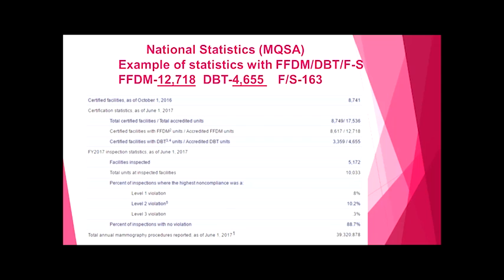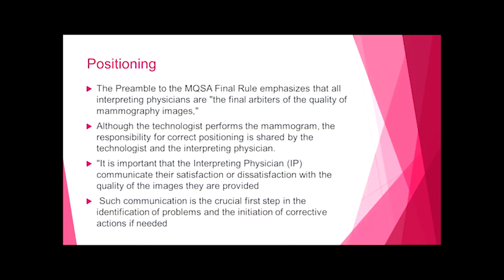And we see that the percent of inspections that occur with no violations, which is pretty amazing when you think about the number of units that we have out there, is 88%. So the actual statistics, or report card, is information that you can find on MQSA's website.